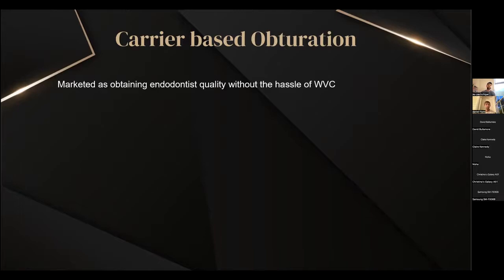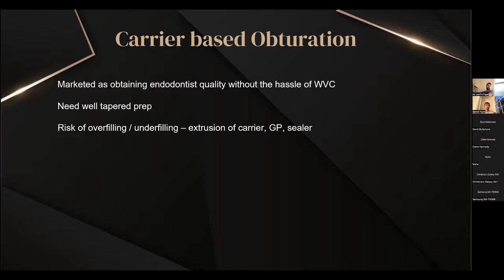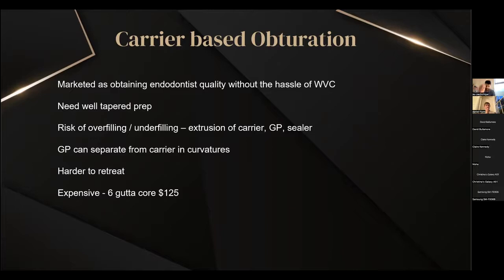So carrier-based obturation. This was marketed as obtaining an endodontist-quality obturation without all the hassle of pluggers and backfills, making it potentially much easier for the general dentist to achieve this type of obturation. Again, you needed quite a well-tapered prep. There was always a risk of overfilling and underfilling, with extrusion of the carrier, sometimes sealer, sometimes extrusion of the GP. The thing I've seen quite a lot when I have retreated these is that in curvatures, the GP can separate from your carrier, so often you don't get any GP at all apically. These can be harder to retreat if your carrier does not come out in one piece. It does make quite a mess. And actually, these are very expensive. I've never used them myself, but when I was looking at the price, this is in New Zealand dollars, they're much more expensive than a normal GP cone.